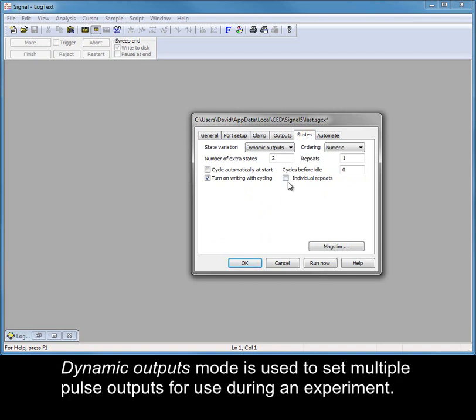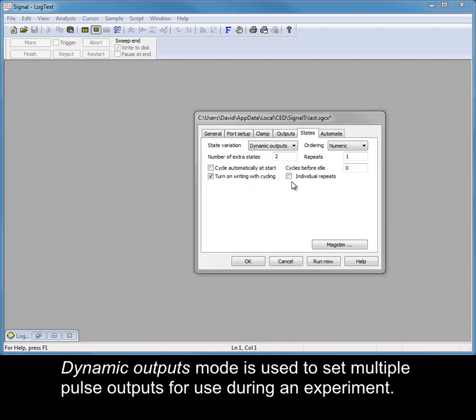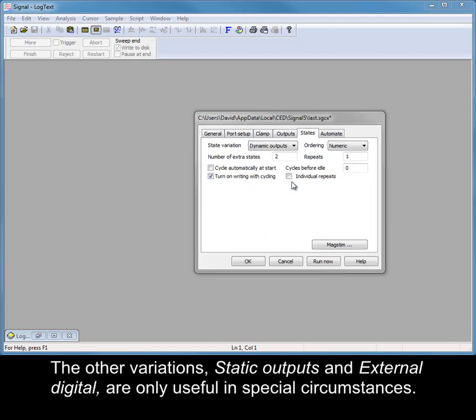Dynamic outputs mode is used to set multiple pulse outputs for use during an experiment. The other variations, static outputs and external digital, are only useful in special circumstances.